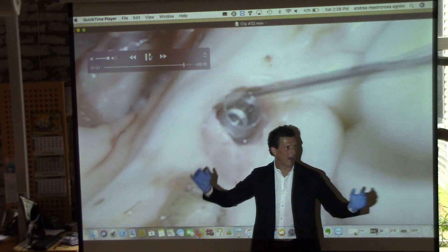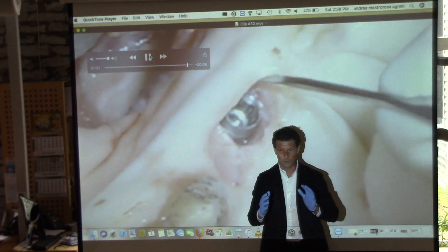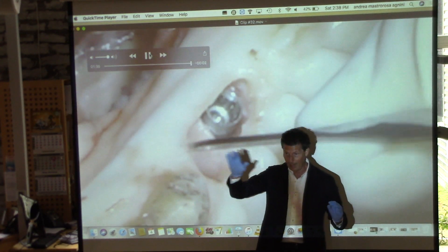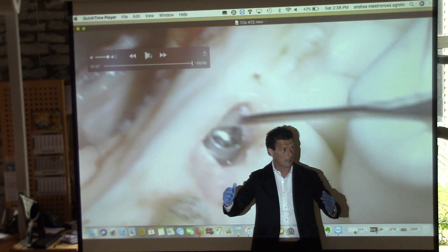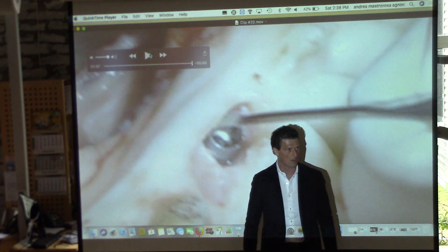Don't cut the gingival margin. I want to preserve the thickness of the gingival margin. Cut the soft tissue to the left. Three or four millimeters at every part of the gingival margin.